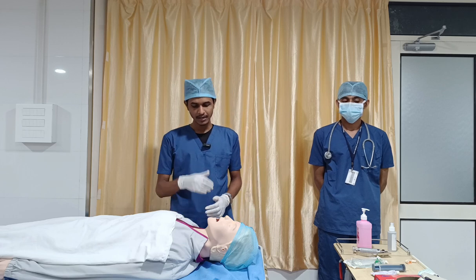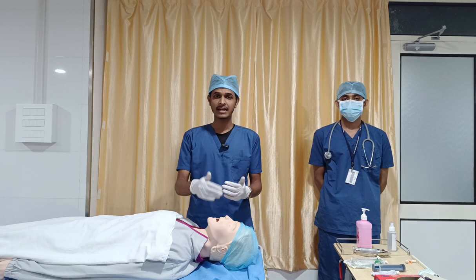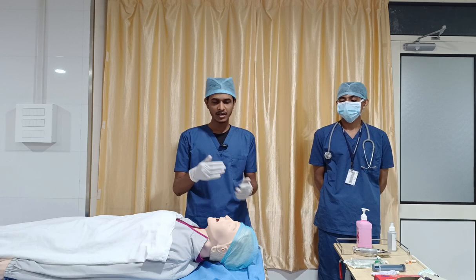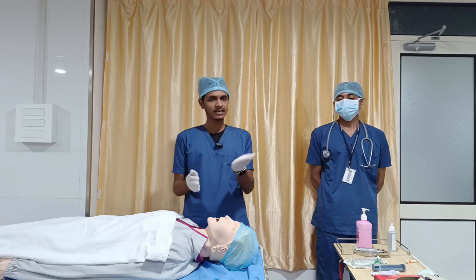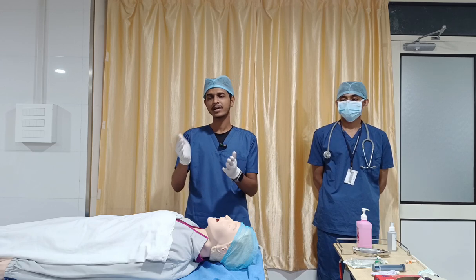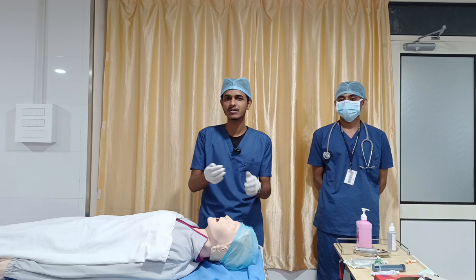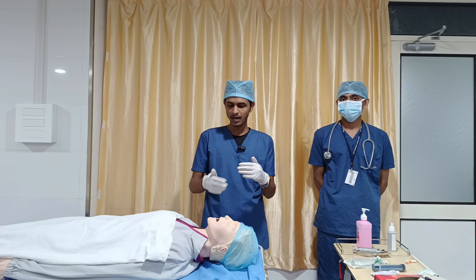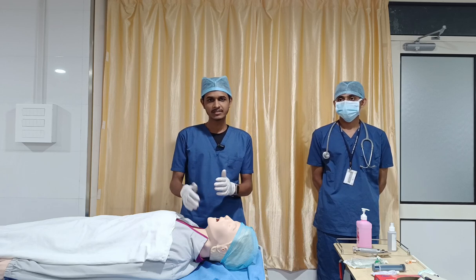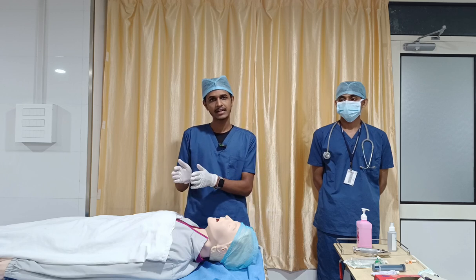And then second thing, before getting into the insertion part, what position ideally do we have to give? If the person is conscious and oriented with you, you can make the person semi-Fowler's. If you are giving complete Fowler's, we can't perform. So you can give semi-Fowler's, or something which is a comfortable position, or you can make the person supine also. If the person is unconscious, ultimately we are going with a supine position only. That is regarding the position.